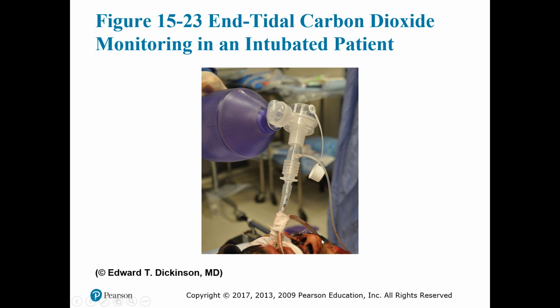So here is an example of a side stream end-tidal CO2 monitoring adapter, and there's the sampling tube that goes to the monitor. That's the piece between the ET tube adapter and the bag valve mask, and that would be the same as if there was a ventilatory circuit there.